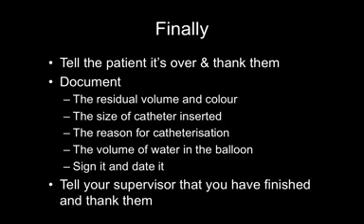You should then document the residual volume and colour of the urine drained, the size of the catheter that you've inserted, the reason for the catheterisation, the volume of water in the balloon, sign and date it, and finally thank your supervisor and tell them that you've finished.